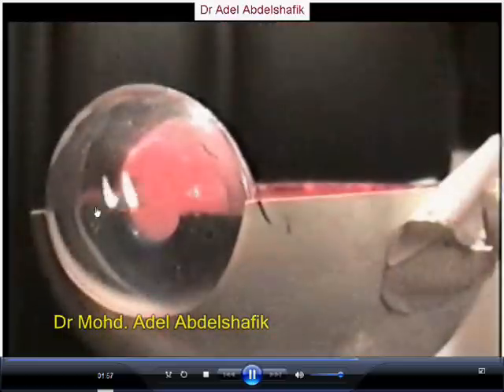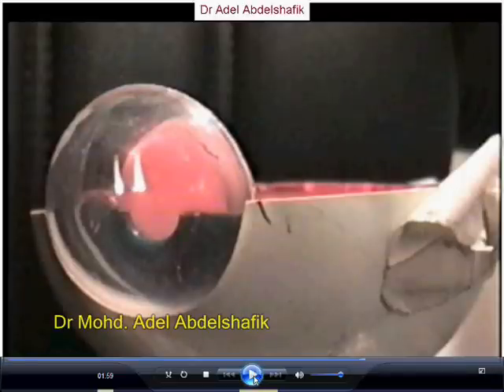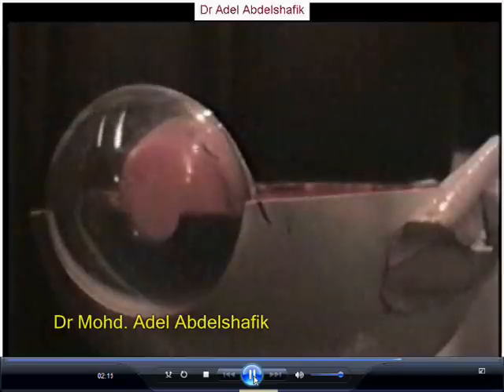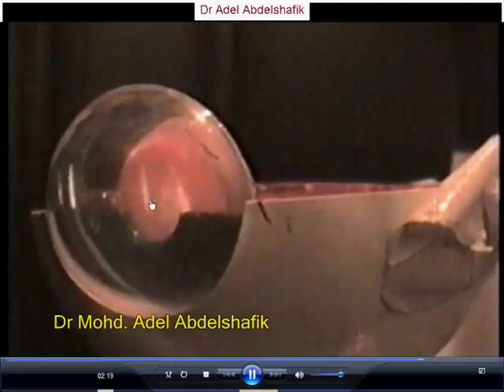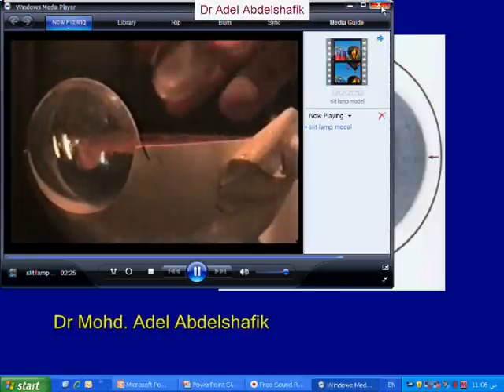Now the cornea is back in place. So we have here the section in the cornea, and here we got light in the lens. In between, this is the anterior chamber. So the slit lamp can make a section in the living human eye. We can make a section in any part we want in the cornea or in the lens, and we can see the thickness of a tissue or distances between one structure and the next. So this is the idea of the slit lamp.